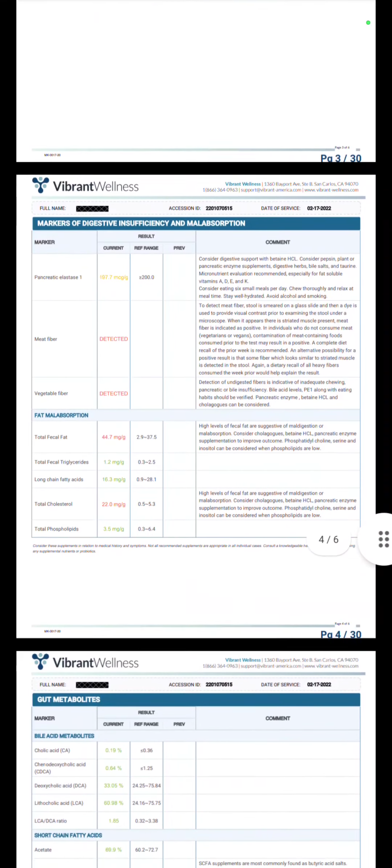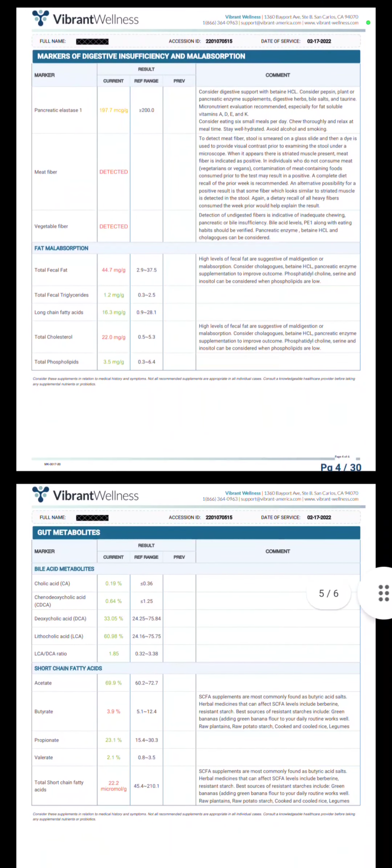And really their biggest issues were coming from overall digestive sufficiency. So we can see here how adequately you are able to synthesize enzymes for breaking down the food that you're eating so that you can get the nutrients from the food. Pancreatic elastase is an indicator of your pancreatic enzymes. You'll see this person is not making adequate quantities. In fact, I like to see it far greater than 200. So right there, we know that their enzyme production is inadequate.